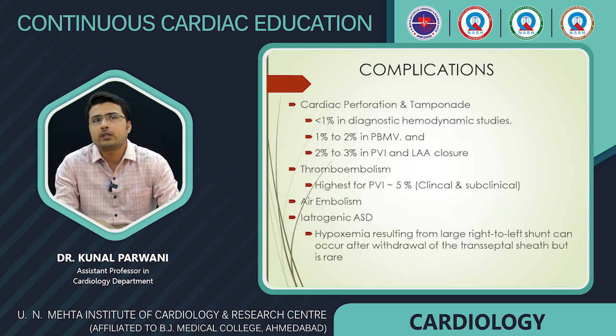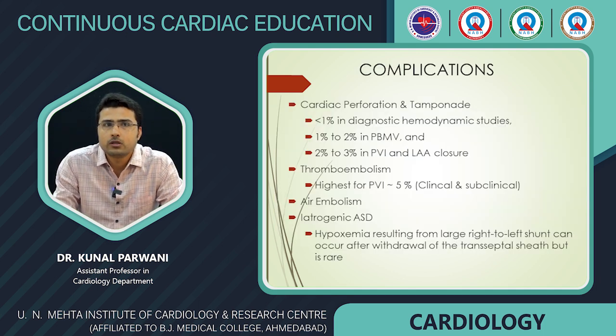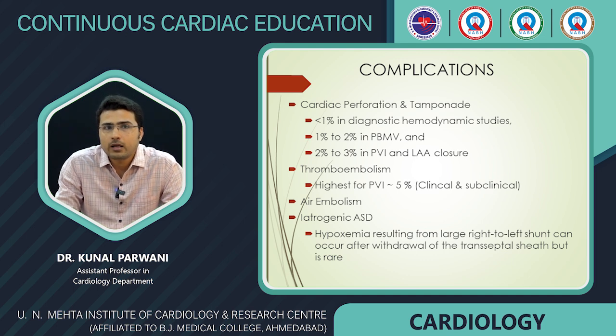Talking about the complications of the transseptal puncture, the most common complication is cardiac perforation and tamponade. The incidence is less than 1% in diagnostic hemodynamic studies, 1 to 2% in performing the BMV, and 2 to 3% in performing pulmonary vein isolation and LA appendage closure. Second is thromboembolism, highest with pulmonary vein isolation, 5%. Third is air embolism. Occasionally, iatrogenic ASD is also created.